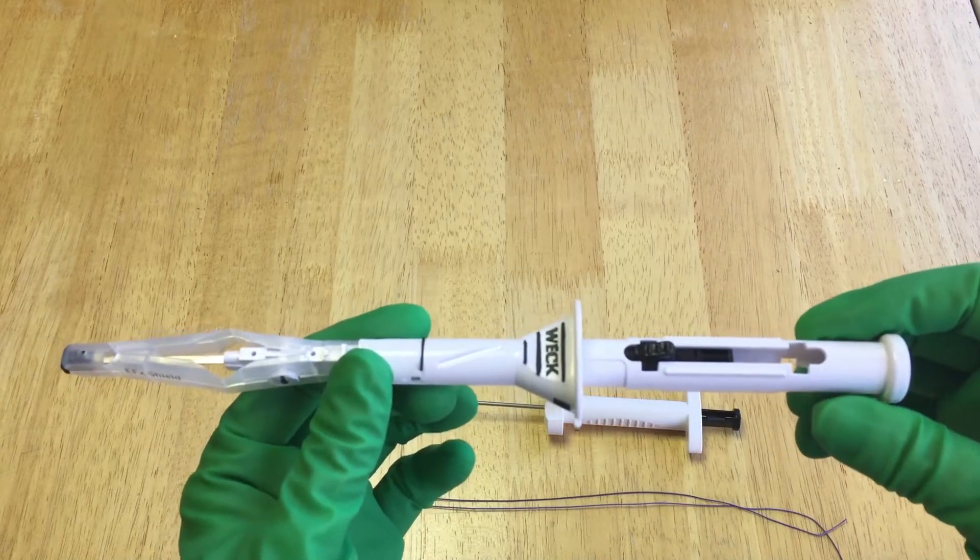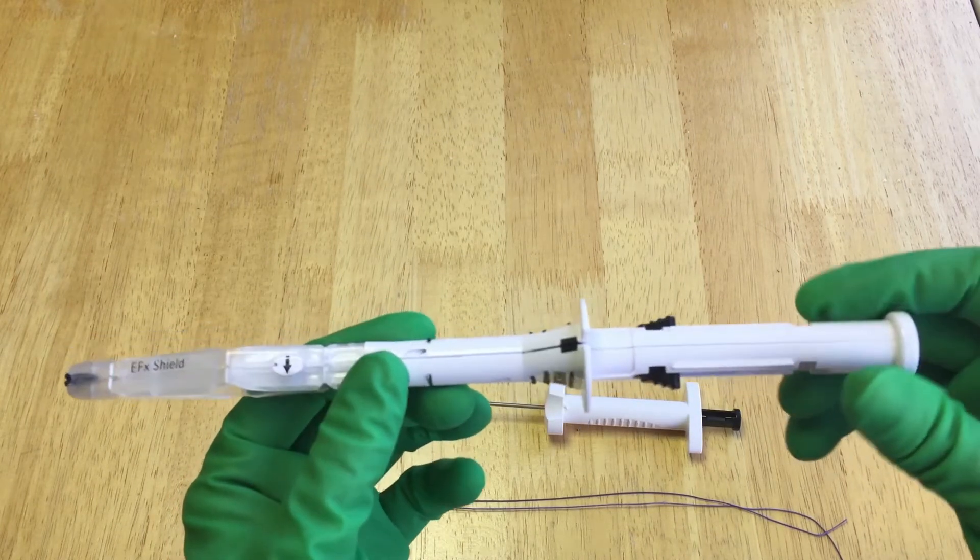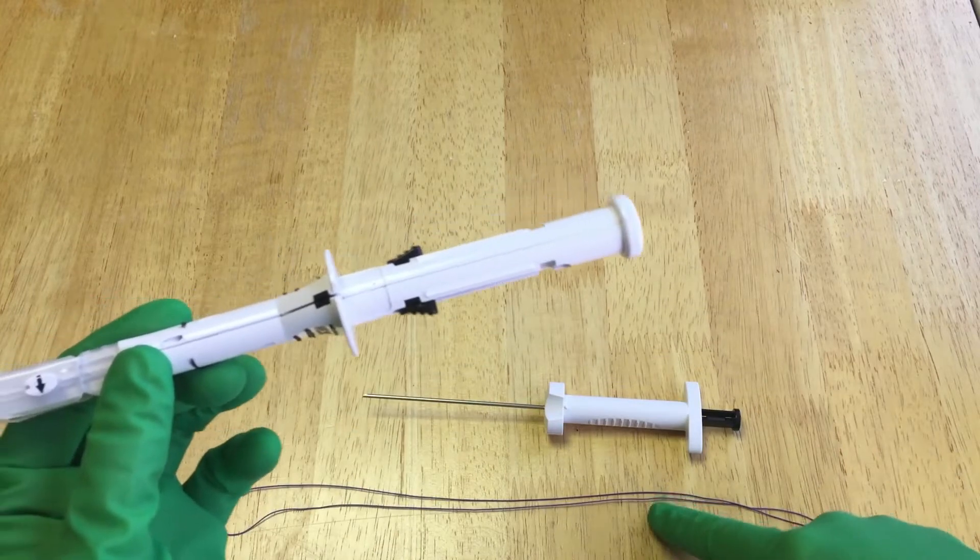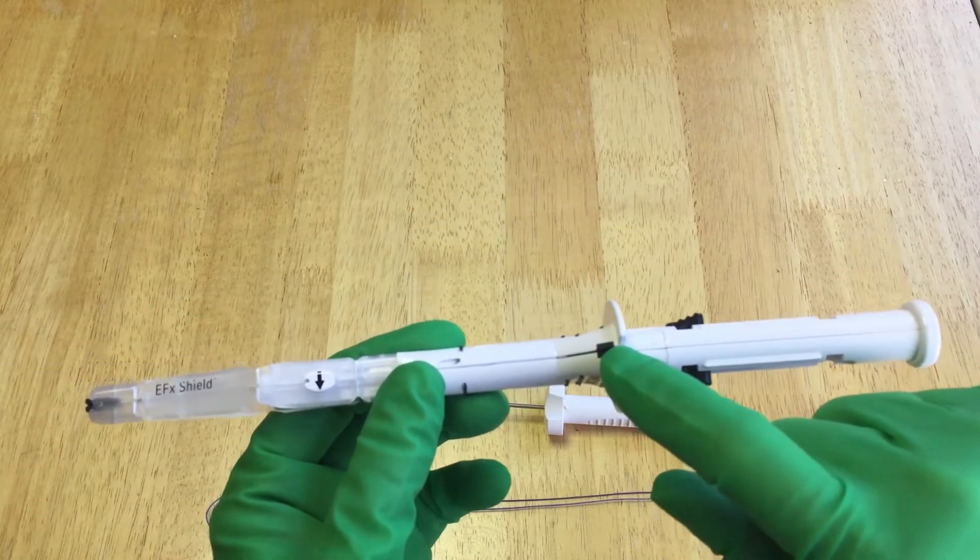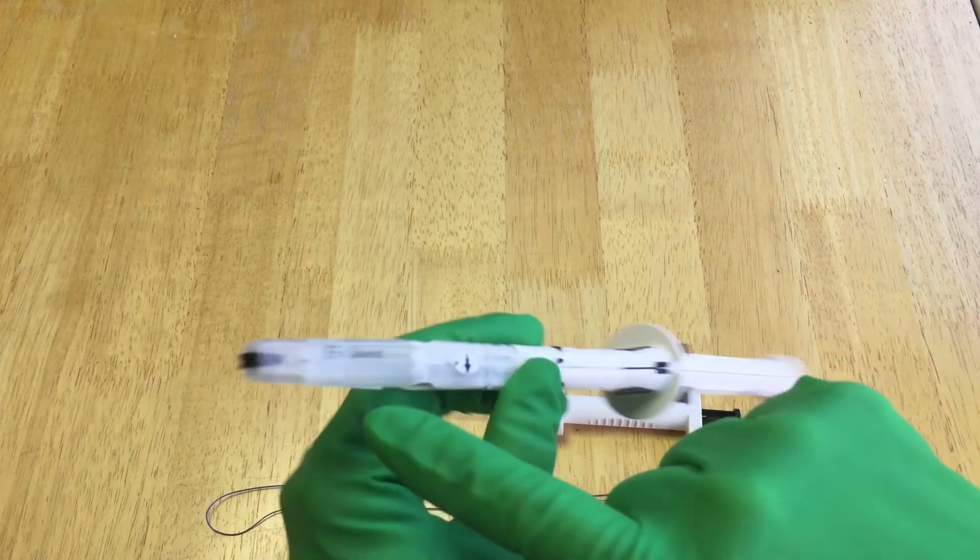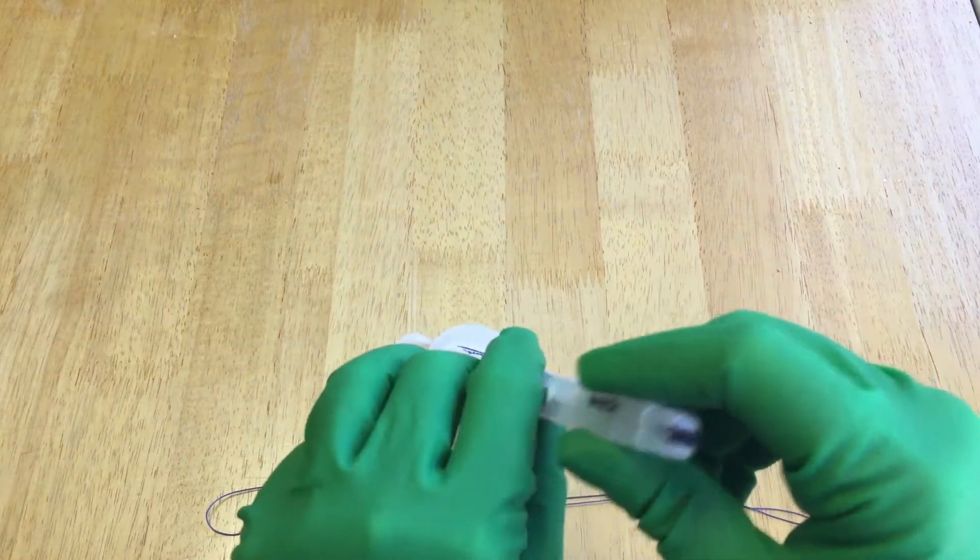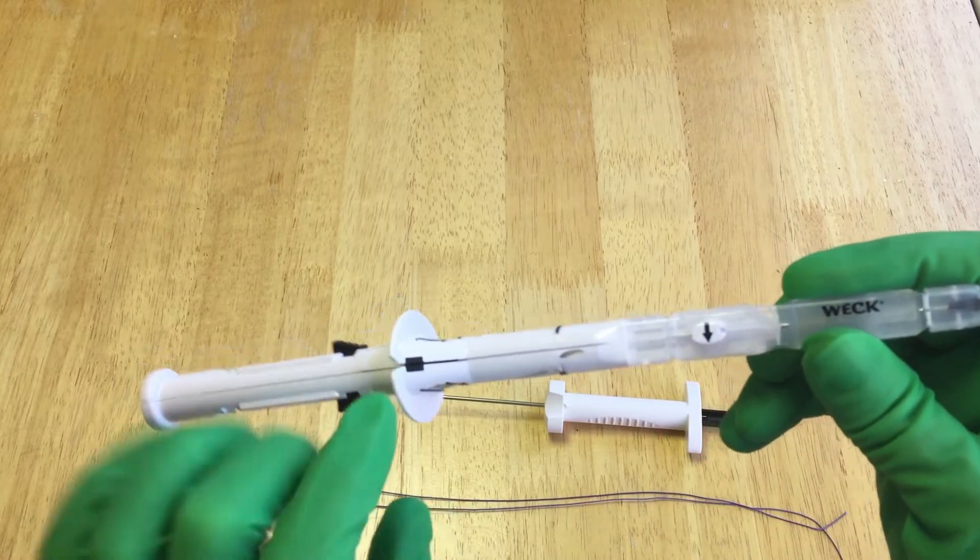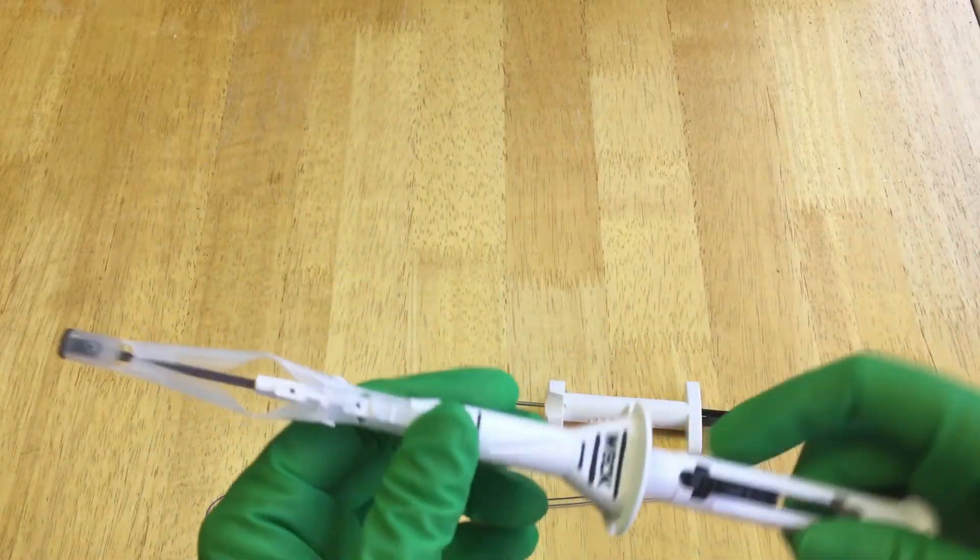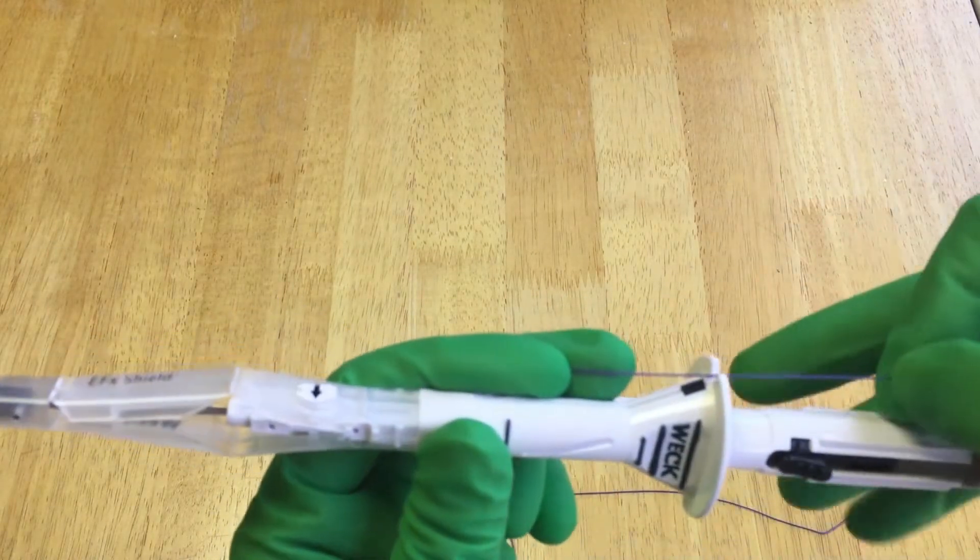So you have the device here which has five. This is a 27 inch suture we'll put it on. Five places to anchor, you put the suture through here. Two around the tip, three, four, and then five on this side, so you're going to be doing that.